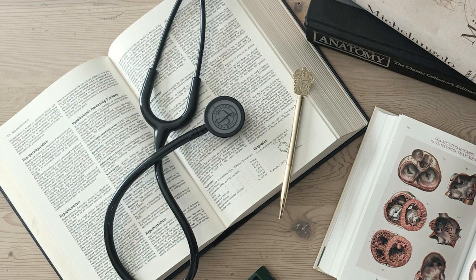Yeah. It's often difficult to identify all the P waves, which might be buried within the QRS or T waves, so you must diligently look at every single lead on the ECG, maybe use calipers, to ensure you don't miss them and accurately assess their independent rate and the complete dissociation.